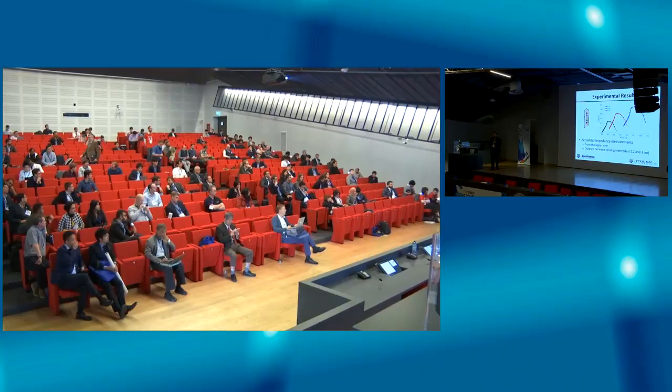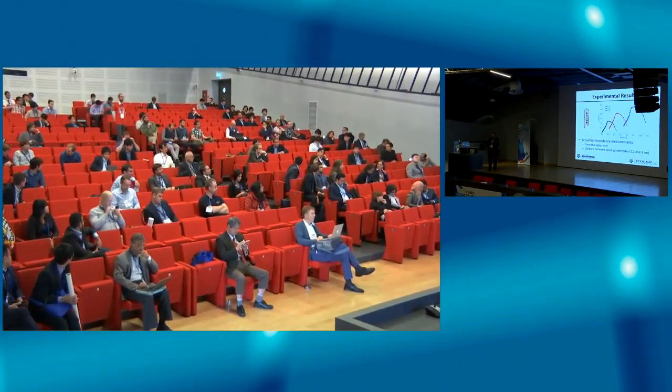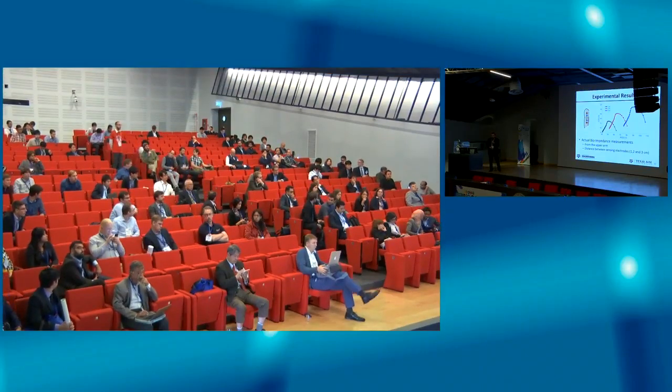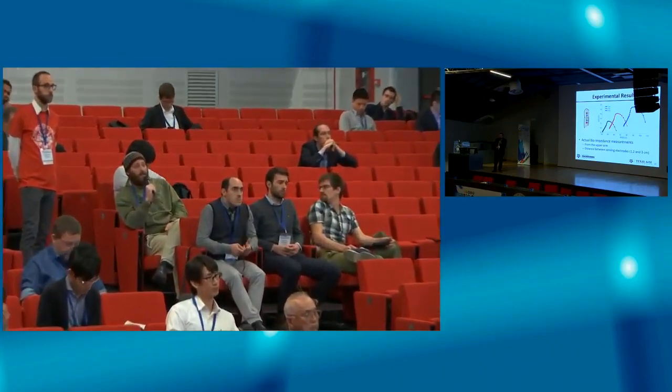Hi, thanks for your talk. I'm coming back to the question about the sweating. It will affect the electrode polarization, actually. Have you thought about any mathematical method to correct that effect? The effect of electrode polarization, a double layer that can be created there because of the sweating.